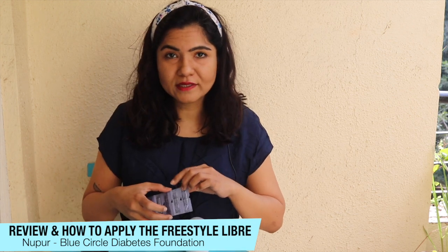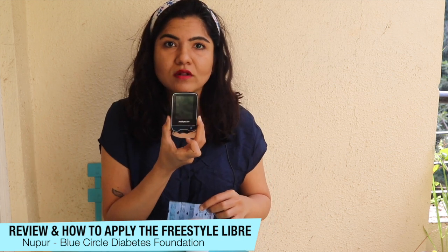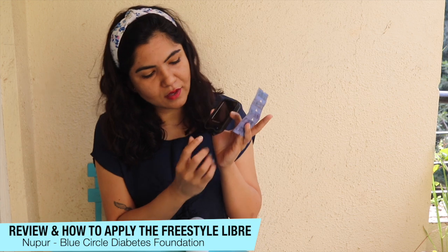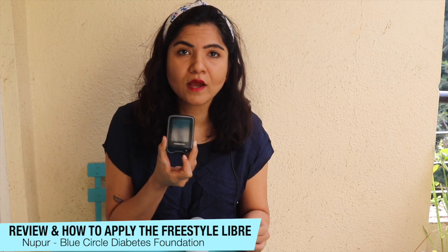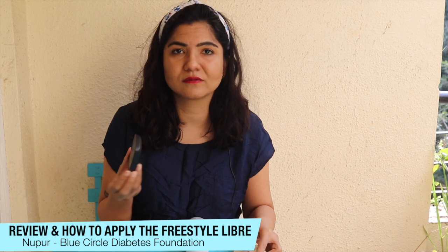I also quickly want to tell you that the Libre Consumer Version reader also doubles up as a glucometer. These are glucose test strips that you can use with this reader — you put in the test strip here and use it as a glucometer. You can also use this as a blood ketone meter, which has separate strips. You put them in, test your blood, and get your blood sugar readings or blood ketone readings with the respective strips.